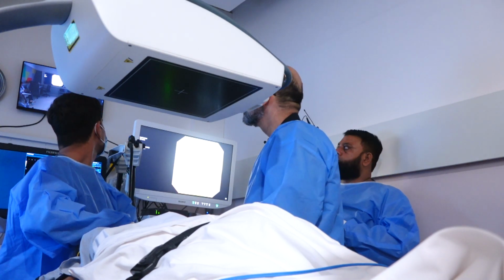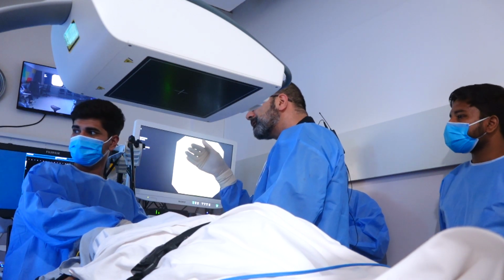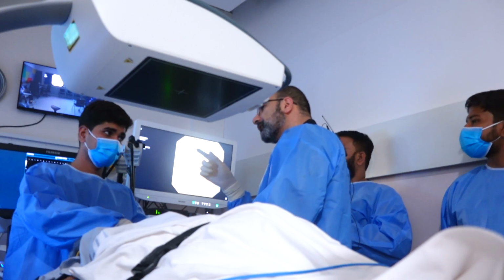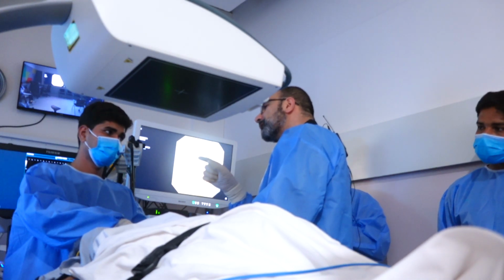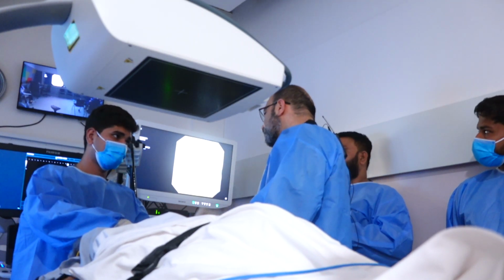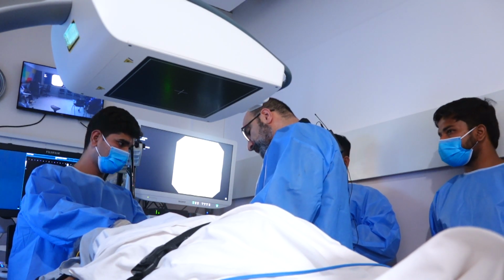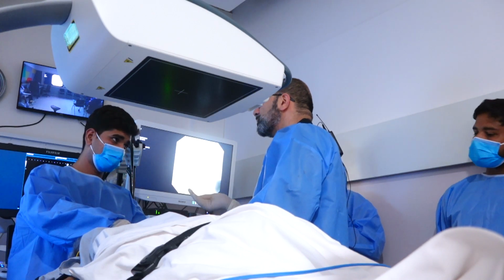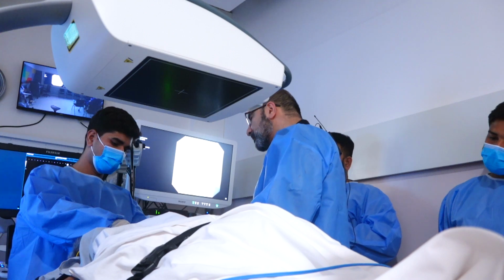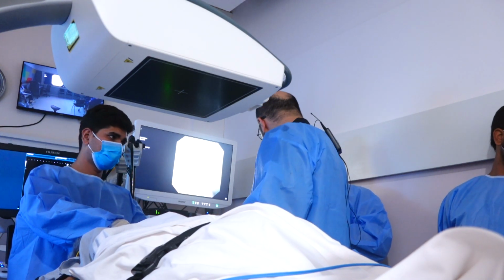Yeah, we can see the fluoro now. Oftentimes how we do it is go down with a therapeutic scope, put a wire down, and put a nasobiliary drain through the scope and back out the scope. But we didn't have a nasobiliary drain available right now, so the alternative that we used to do is put the wire down and then go with a stone extraction balloon over the wire. So that's the part we're about to do.